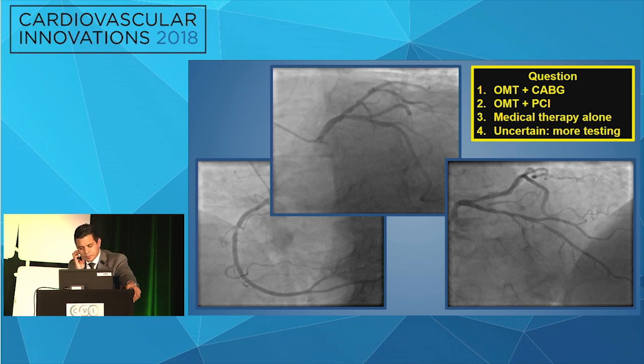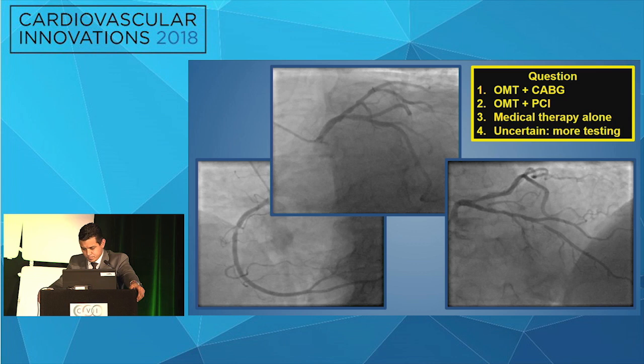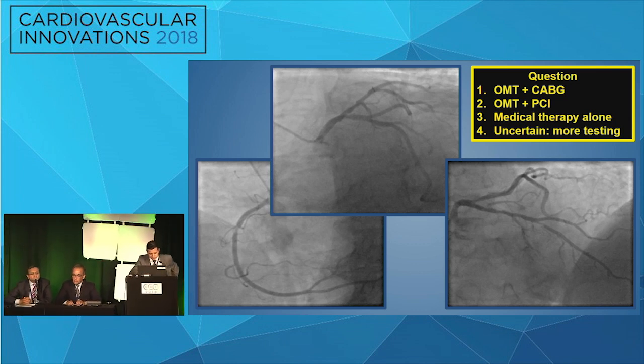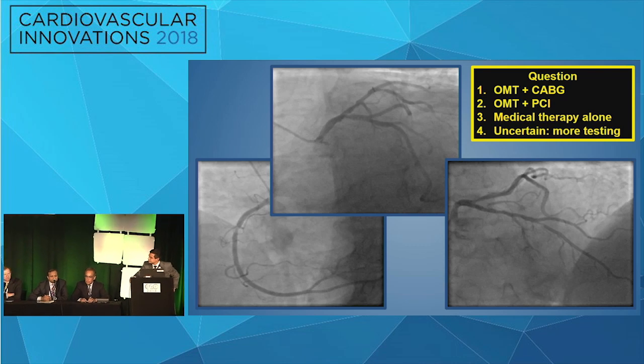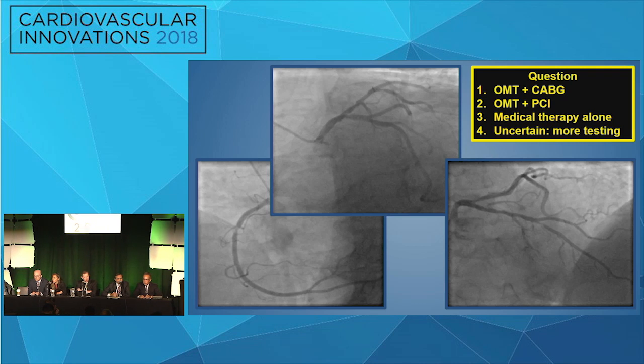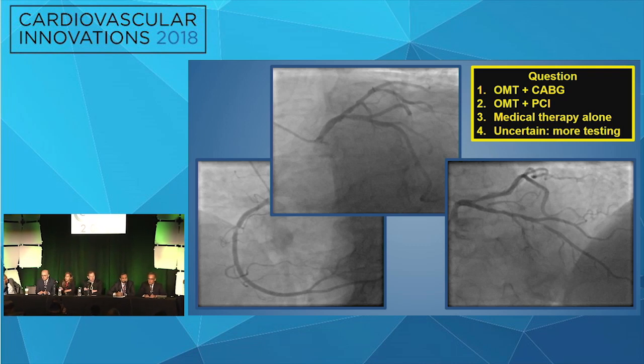All right, Sheila, so this is your patient. What do you want to do? I would perform FFR. I think the LAD is clear. I would perform FFR of the RCA to start. And maybe I would do a steep caudal view of the circ just to outline that ostium, and then make a decision about FFR in the circ.